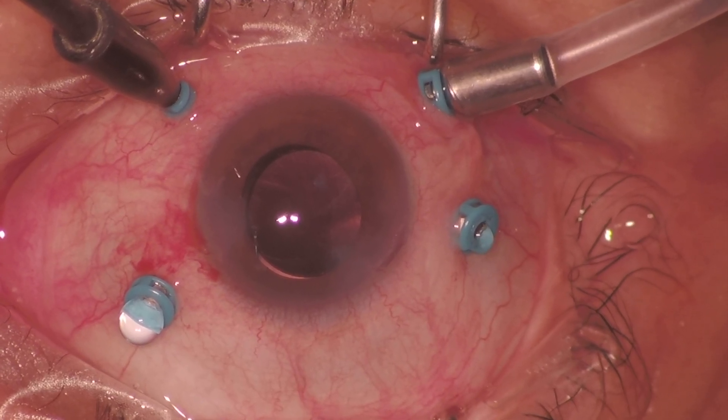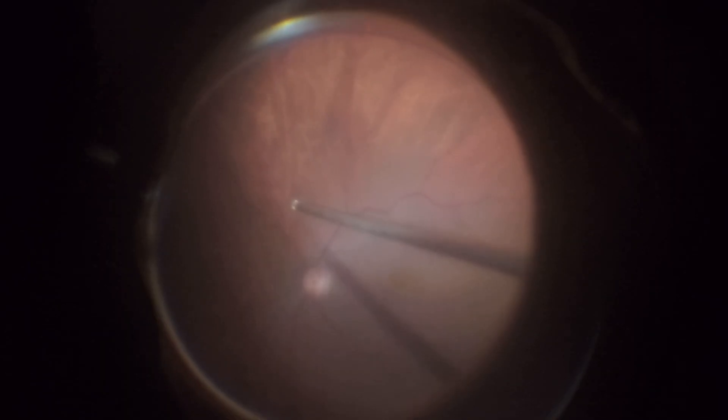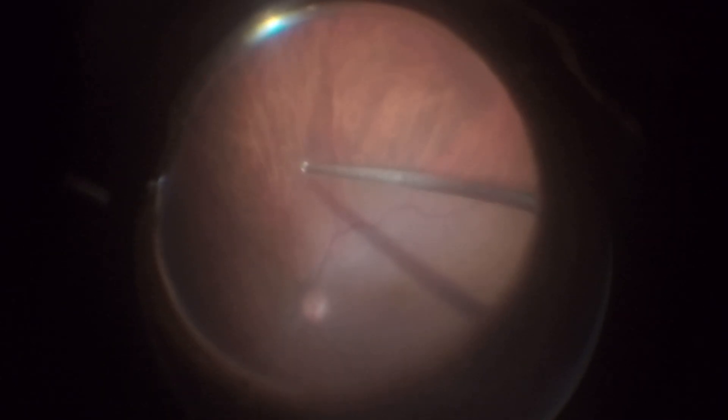In this case, shared by Dr. Felipe Lucado from Salvador, Brazil, we observe a pars plana vitrectomy performed on a 50-year-old woman with an idiopathic extra-large macular hole, as classified by the CLOSE study. The surgery was planned with the use of the inverted internal limiting membrane flap technique.